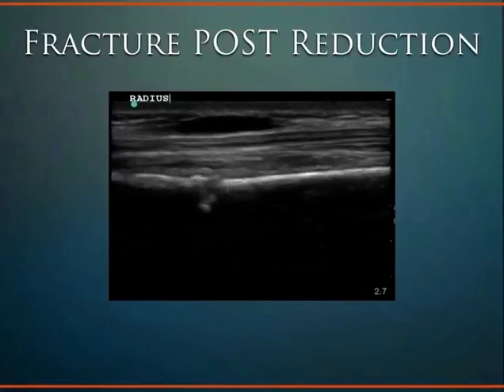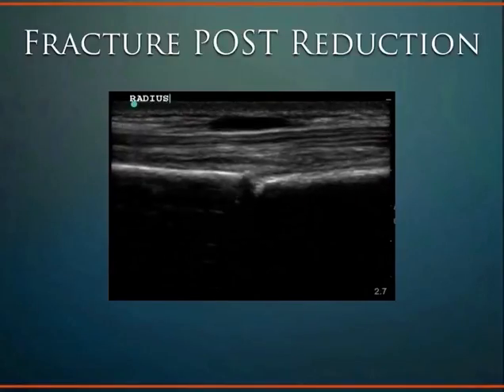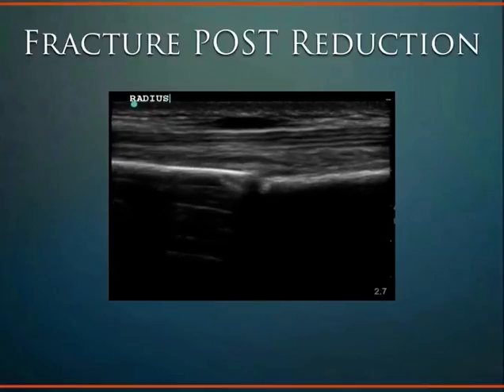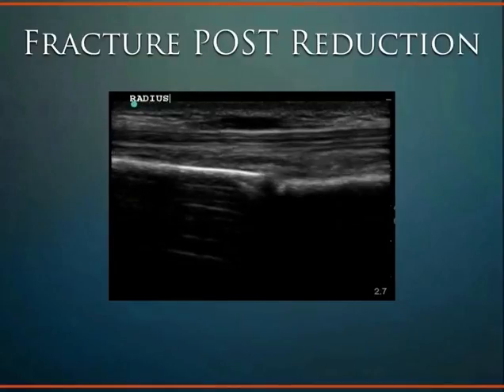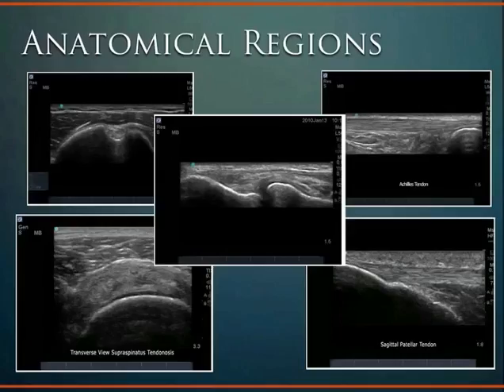And if you've ever done this clinically by traditional methods, it can be quite cumbersome because you get the x-ray, you show the fracture, then you have to have the x-ray up, you're looking at the x-ray, you're trying to visualize the fracture, and you're moving it in what direction you feel is appropriate and by protocol. Then you have to splint it, and then you send them back to x-ray, and then they get another x-ray, and then they come back, and you look at it, and it's like, oh shoot, we're a little bit off, got to realign it, and then get it good, and then splint them and send them back to x-ray. It's this cumbersome process, whereas you put the ultrasound machine on there, you're watching the anatomical alignment, splint it, and we're all good. And so it can be quite useful and to the patient's benefit.